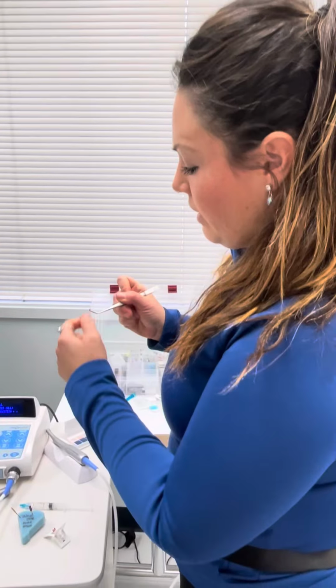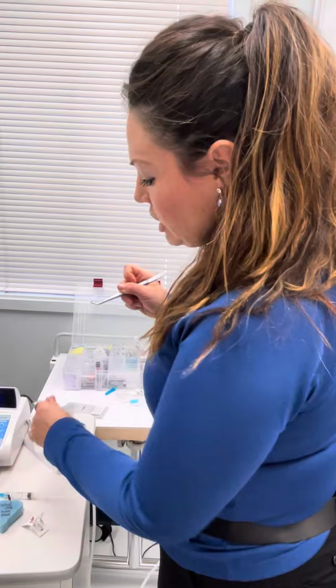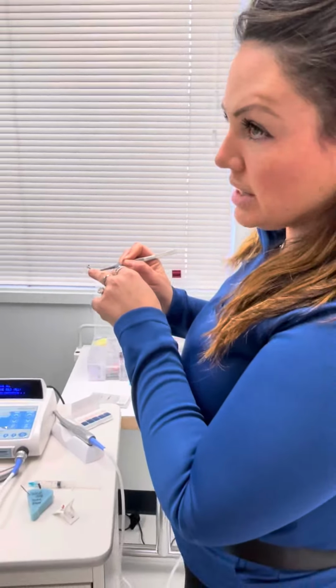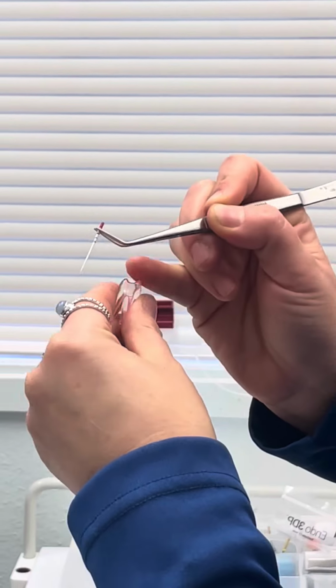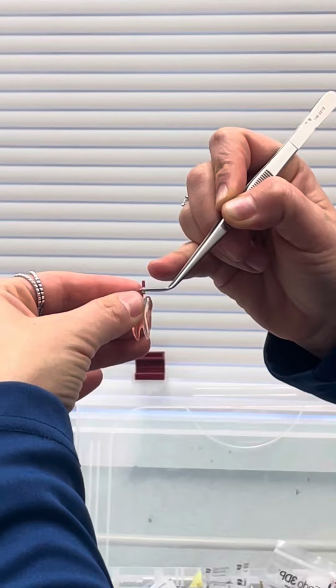This one is going to fit our file, or our shape that we've created with our file, perfectly into the tooth. The other thing that's very nice about these is they do have the same sizing, and we're working off of the same sizing chart. Just like I talked to you guys about weighing yourself on different scales, you're going to get mixed numbers. So you're going to go ahead and dry.